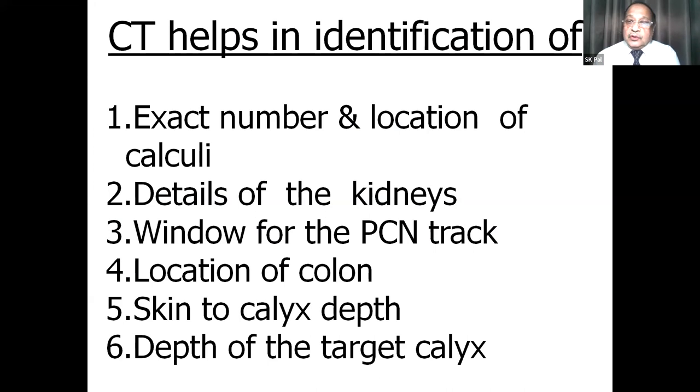So CT shows us the exact number and location of calculi. It shows us the details of the kidneys. It also shows us the window for the PCN track. We will be discussing it nicely. It shows us the location of the colon. You can measure the distance between the skin and the calyx which you are going to puncture. You know how much depth you will be going in. And the depth of the target calyx can be pointed out on the patient's body.